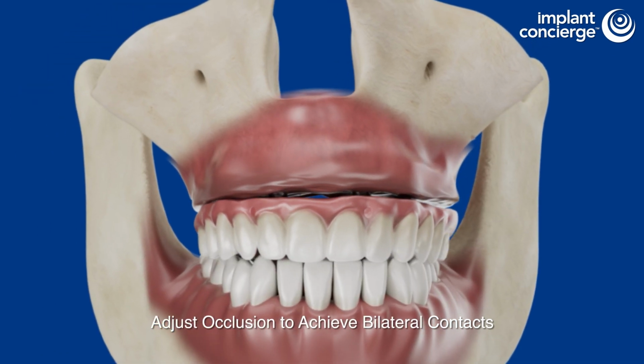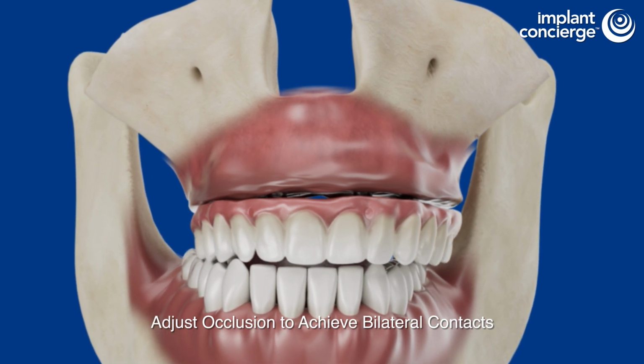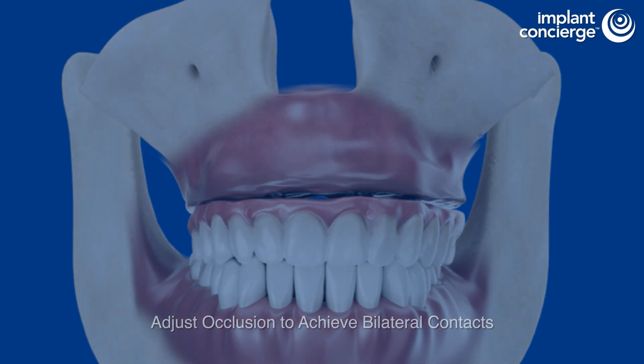It is common for the bite to be slightly open immediately after surgery. Final occlusal adjustments should be made 24 to 36 hours after the procedure.